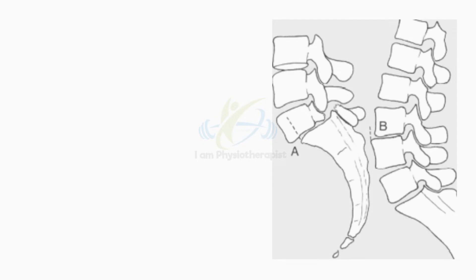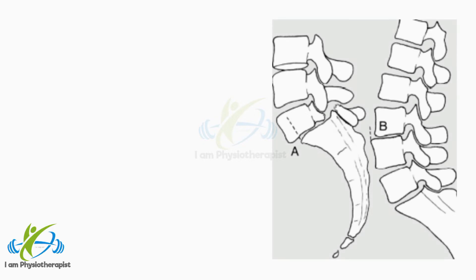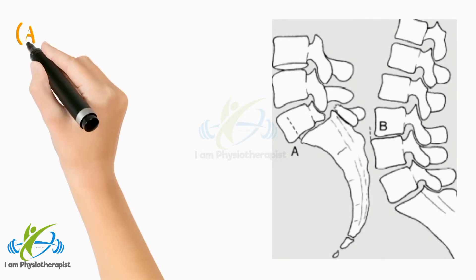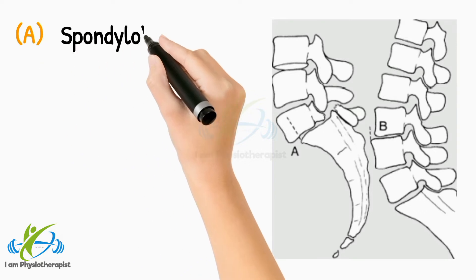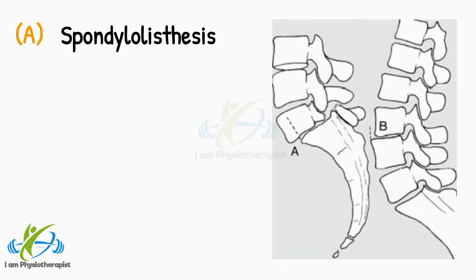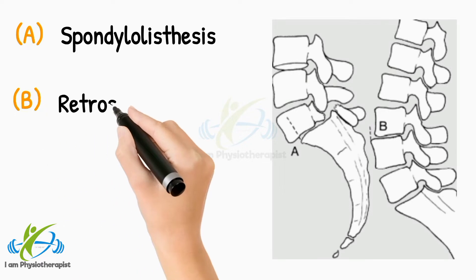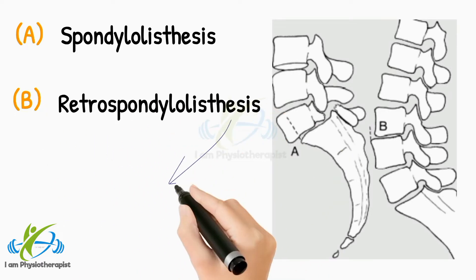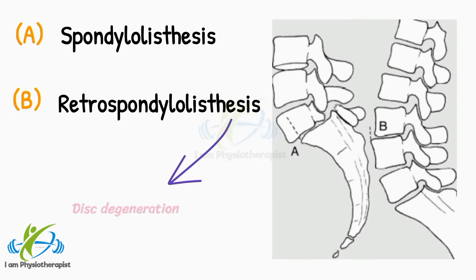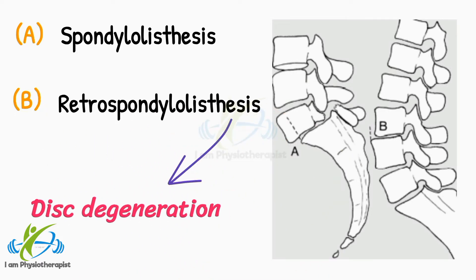Note the relationship of each vertebra to its neighbour. In particular, note spondylolisthesis as shown in point A. Point B shows retrospondylolisthesis, usually associated with disc degeneration.